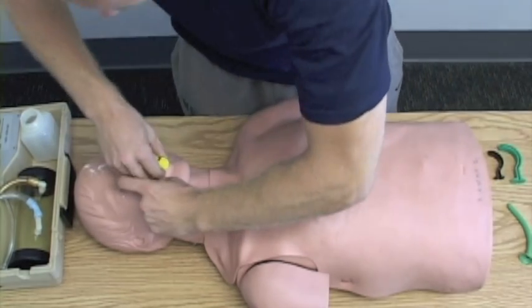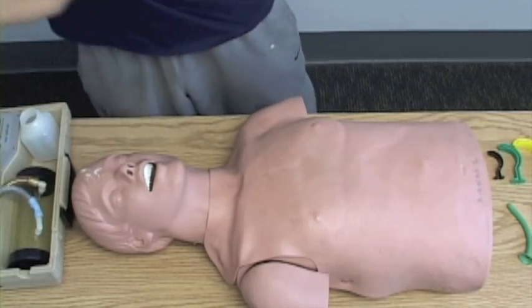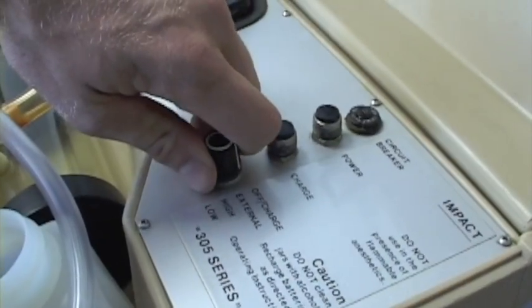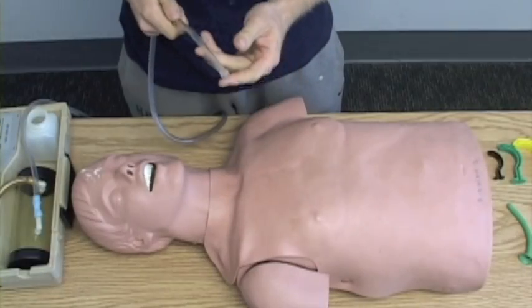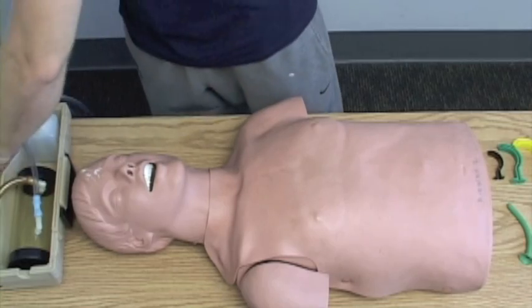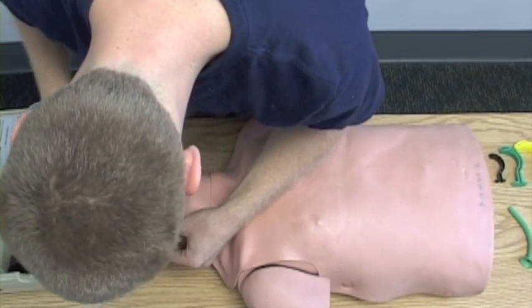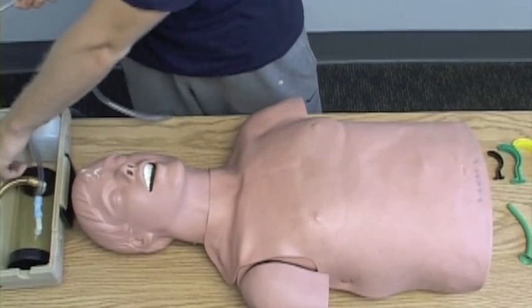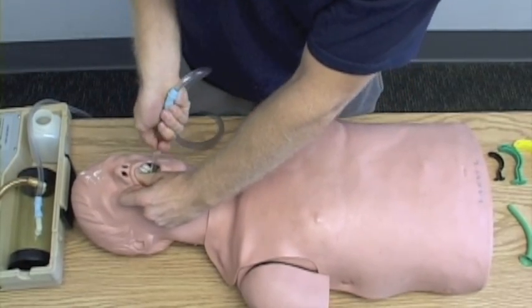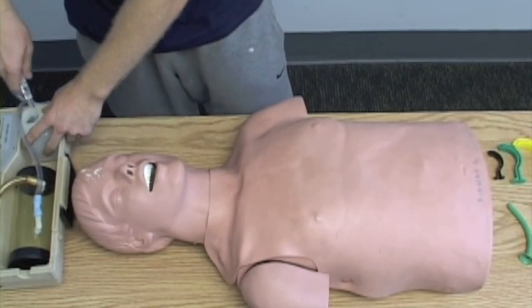I'm going to move it in a similar fashion. I'm going to take my suction. Check for suction by pressing on the valve. I'm going to measure it from the ear to the mouth. Insert without suction, then suction with a sweeping motion for no longer than 15 seconds. Clean it.